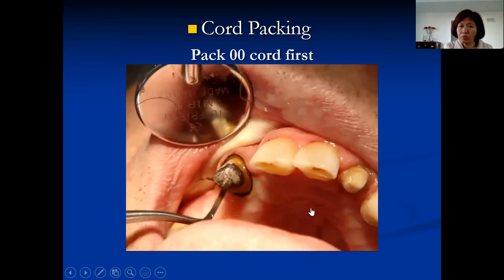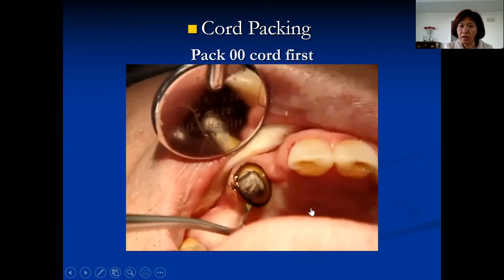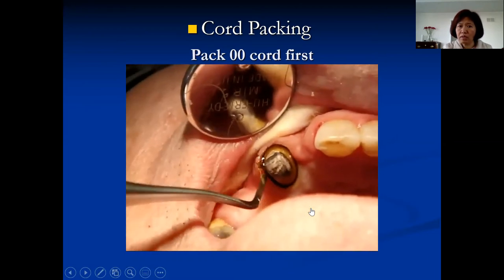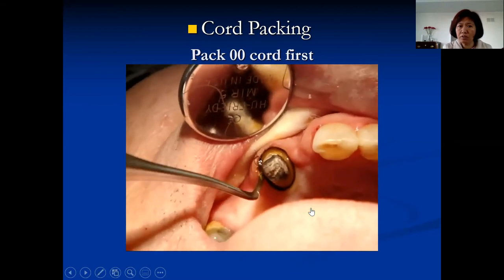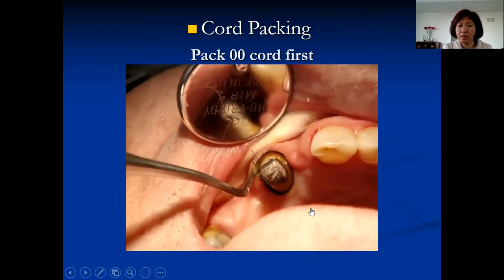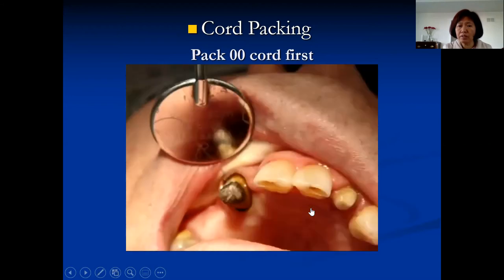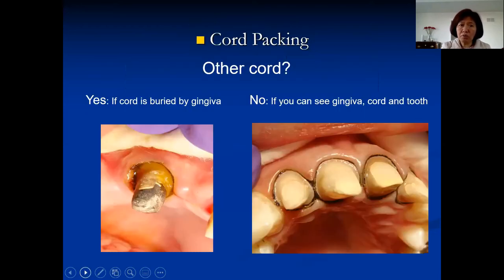You can see the cord goes down with a little rolling motion, not just pushed straight down — otherwise the gingiva bounces and pushes the cord out. Pack everything in and sometimes leave a little tail. A common question students ask me is: do I need to pack more cord? I tell them there's a way to decide whether you need more cord or not.